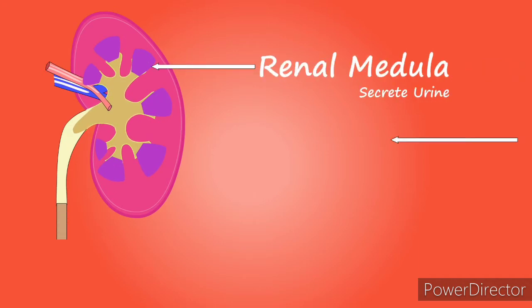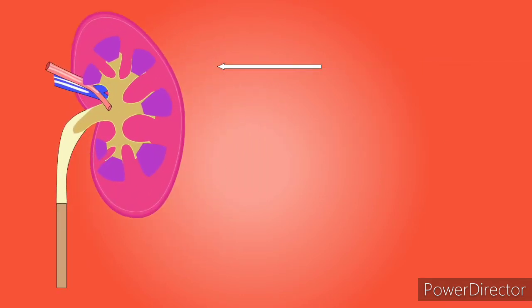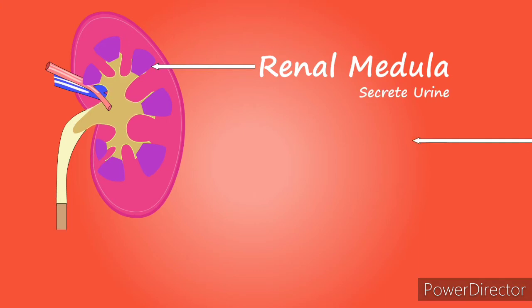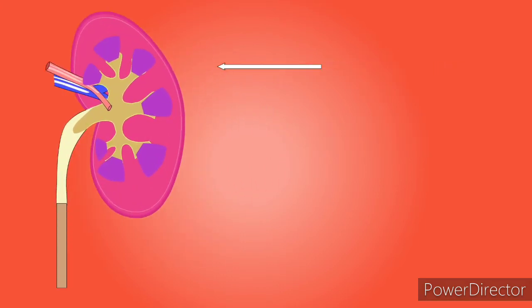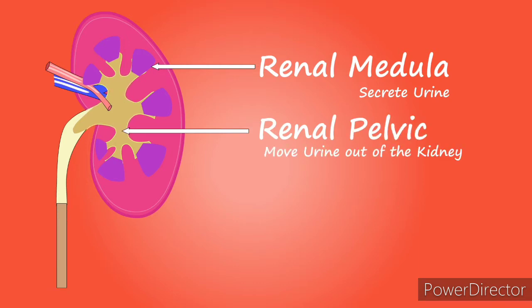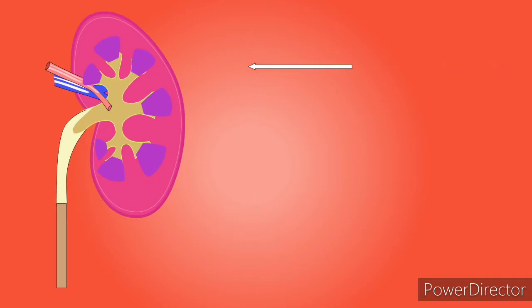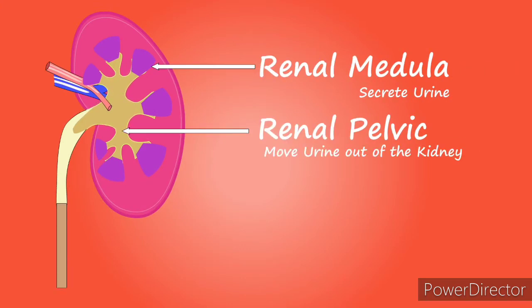So in this video I'll be talking on urine analysis or urinalysis. Some of us, when we do our laboratory test, we see urinalysis is one of the routine tests in the laboratory, but it has a lot of information with it. So I'll talk extensively on this urinalysis. So what is urinalysis? Urinalysis is the physical, the chemical, and microscopic examination of the urine.